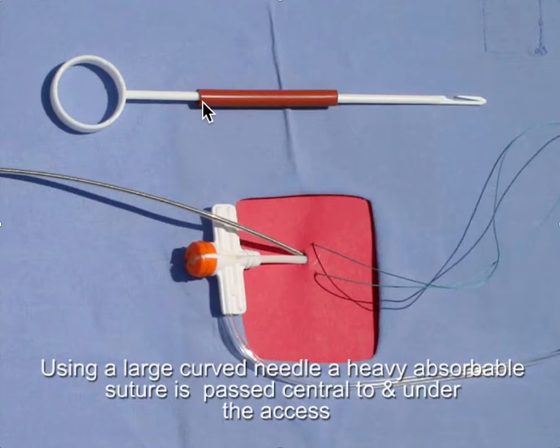We're going to use this device, which is actually used in open heart surgery for cannulating the left atrium. It consists of this little plastic fish hook and a piece of soft rubber tubing. It just happens to conveniently come in a package for that purpose.